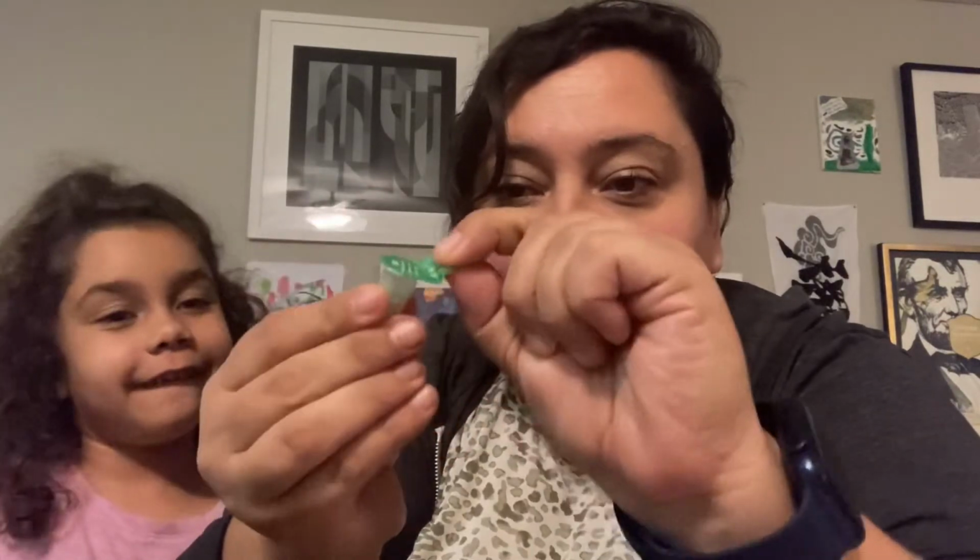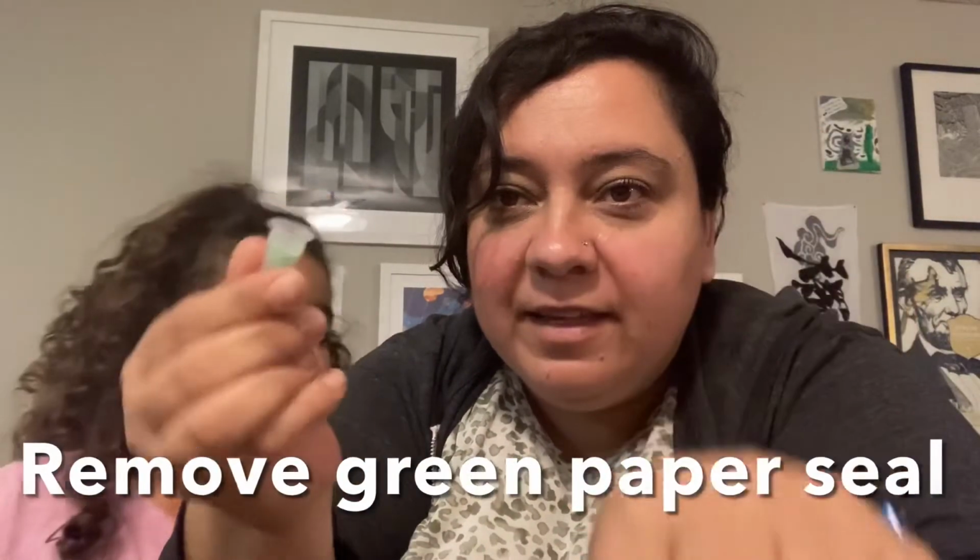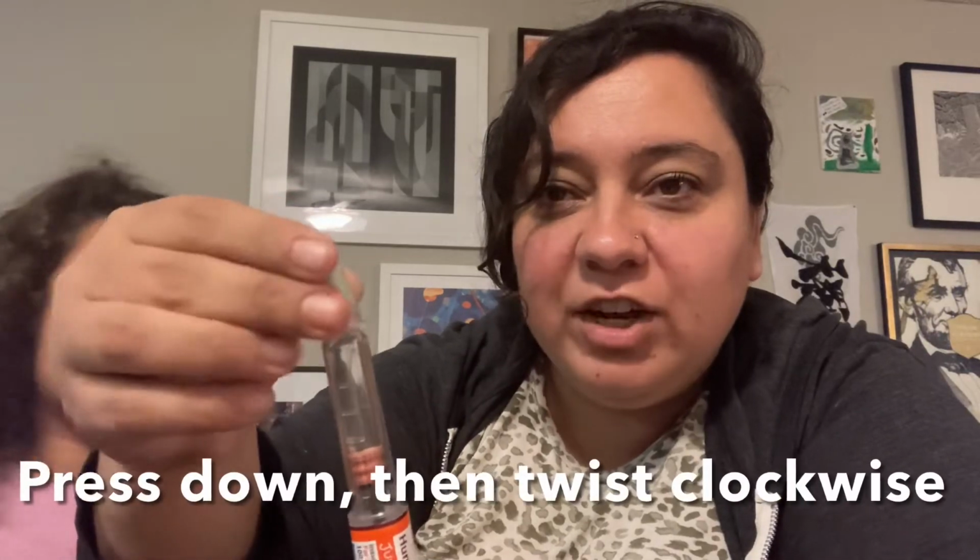So what you're going to do is take this pen needle and take off the green seal. The needle is now inside. And we've previously determined that Care-olina is going to be receiving half a unit of Humalog for this chocolate. So we're going to take this needle and put it on the pen so we can do the injection. You're going to put it on the top, press it in, and then turn it clockwise until you meet resistance. It's screwed all the way on.